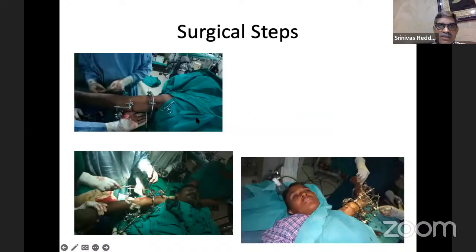And these are the surgical steps. See, proximal arch, middle full ring, and this is a 5/8 ring which opens anteriorly to facilitate the range of motion of the elbow joint. And here at the level of the elbow, generally we pass 3 wires, if not 2 wires plus 1 Schanz pin.